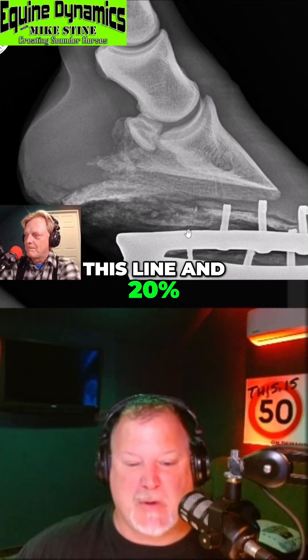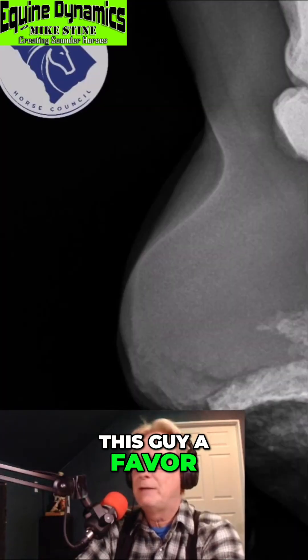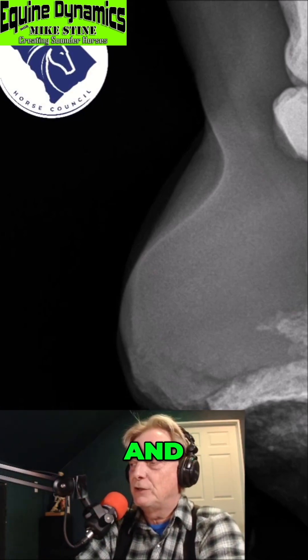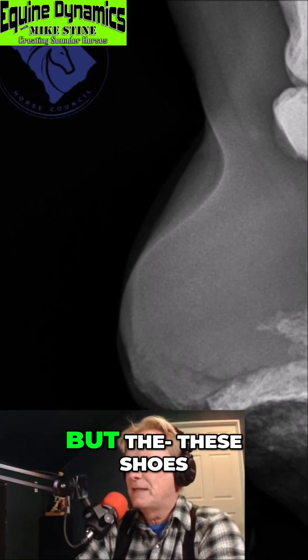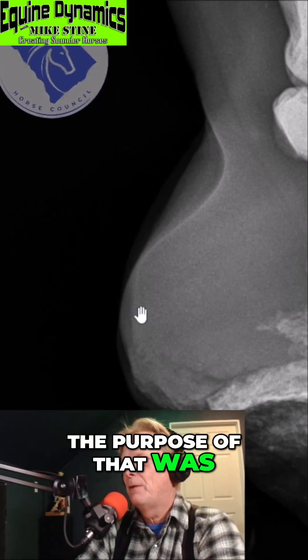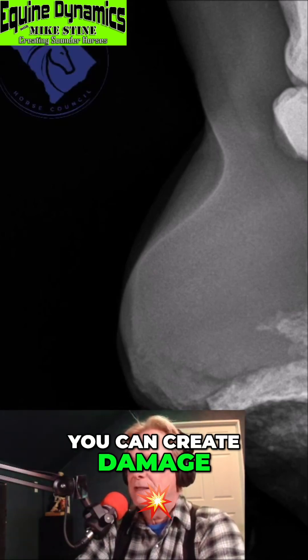The shoes are still on — they've probably done this guy a favor if they had come off, because at this point they're doing a lot more damage than they ever did any good. These shoes have a lot of traction on them, and I don't know what the purpose of that was, because sometimes you can create a lot of damage by too much traction. You can also create damage by not properly fitting a shoe.